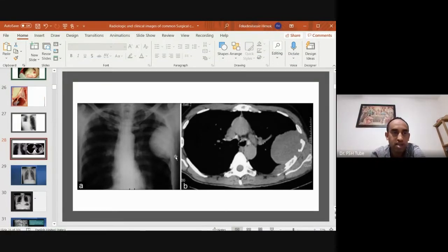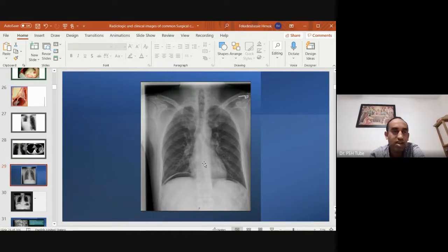So it's a pleural-based mass. It's not pneumothorax, it is not empyema or something like that. So now this kind of help gives you an idea. Okay, let's go to the other chapter. So what's your spot diagnosis? Straightforward.